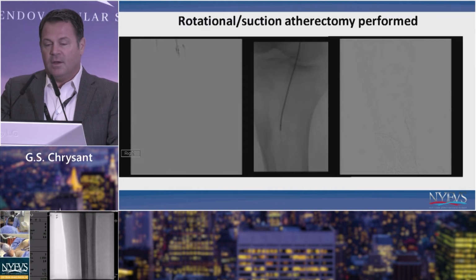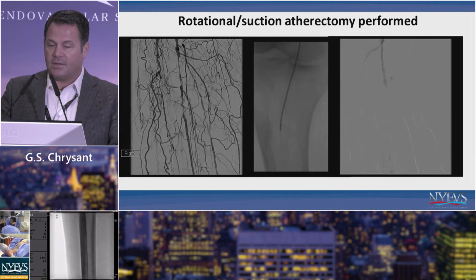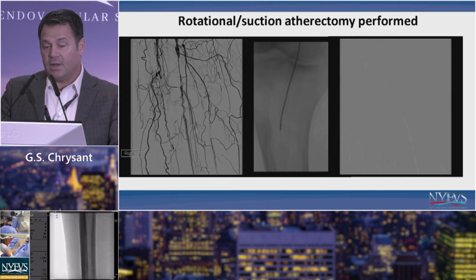So in this particular instance, I chose a rotational device to get through the peroneal. And you see on the left the before and on the right the after. And that's just immediately after just atherectomy. It's pre-PTA.